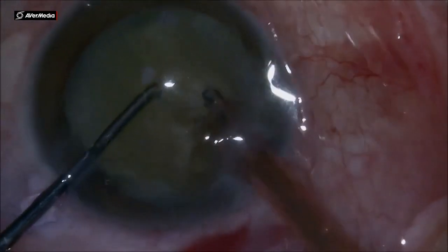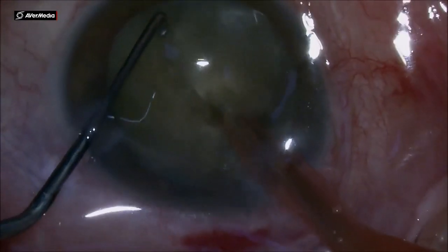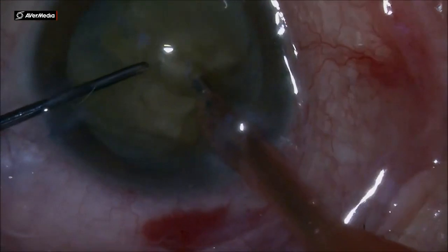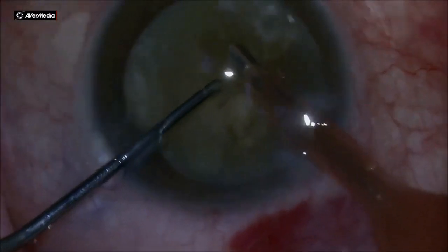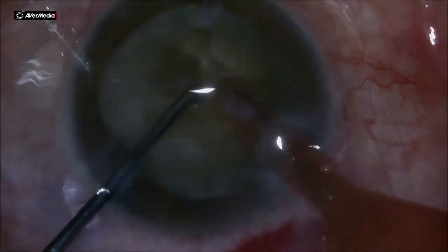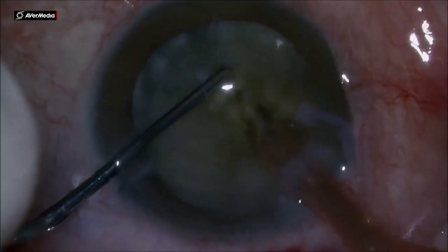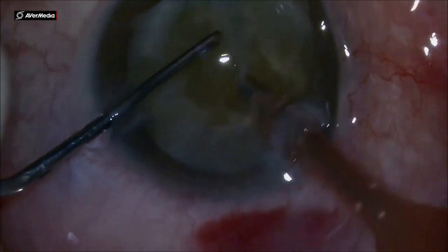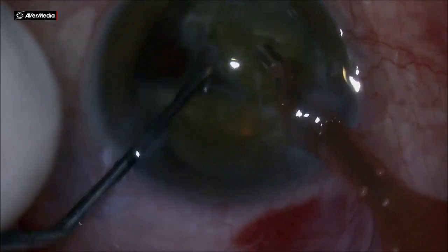With this new chopper, it's a short chopper, not a very long one that I like to use in these leathery cases. It's making a partial crack and then rotating the nucleus. I divide the nucleus further and have another partial crack here, insisting on that posterior plate to crack. And it's always a good idea to have two distinct heminucleuses when you deal with these leathery cataracts.